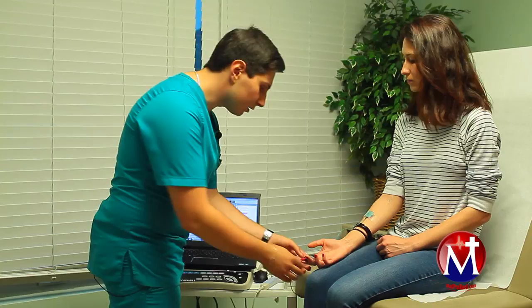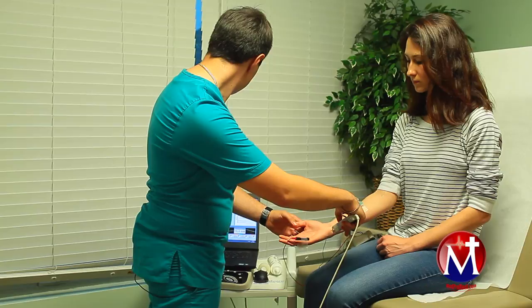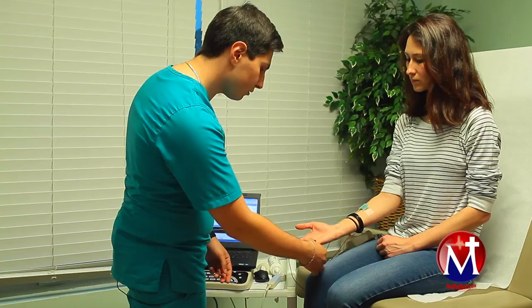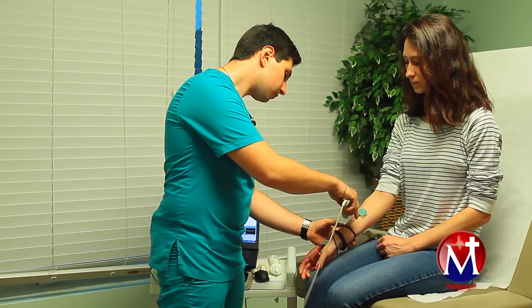Next nerve will be ulnar sensory on the pinky finger. Also apply the stimulation on the wrist. We get normal latency, normal amplitude, and conduction velocity. The last nerve for this upper extremity will be radial sensory. And it's normal.